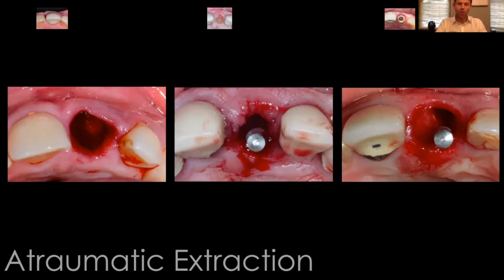So I always angle and position my implants in the anterior so that I can get a screw-retained crown on there. Obviously, the tissue on the one all the way to the left, you can see needs some support. So if you just put a healing abutment on there and let the tissue heal, all that tissue would collapse. The important part is to keep and maintain that. And so how do you do that with a temporary?